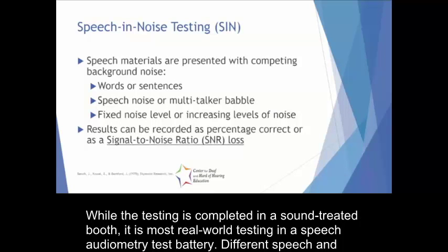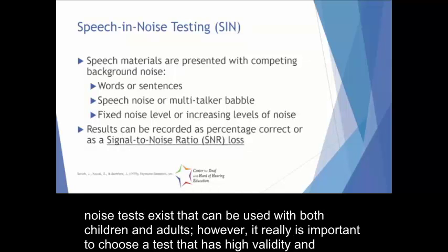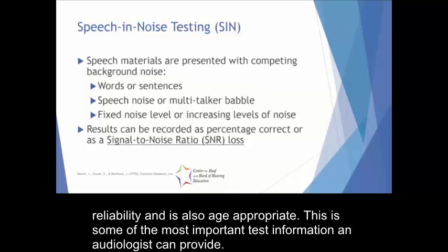While this testing is completed in a sound-treated booth, it is the most real-world testing in a speech audiometry test battery. Different speech and noise tests exist that can be used with both children and adults. However, it really is important to choose a test that has high validity and reliability and is also age-appropriate. This is some of the most important test information an audiologist can provide.